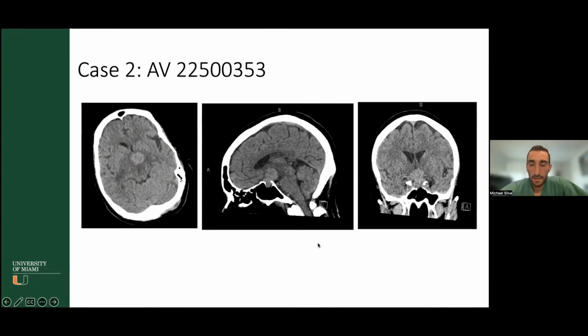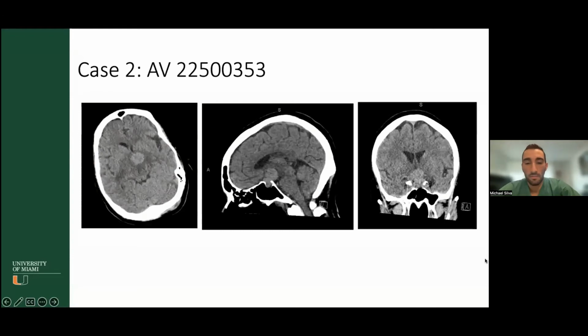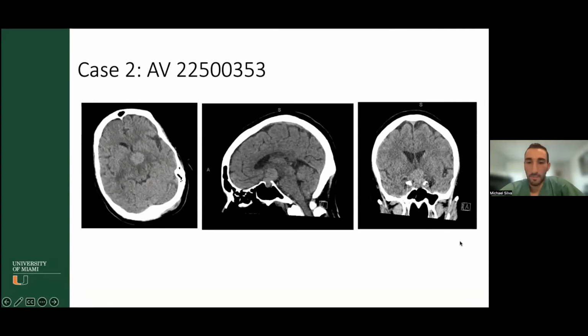What do you think about the location? How does the sella look? Where would you describe this tumor as being located? It's extending into the suprasellar region. And does the sella look normal, abnormal? Looks a little eroded. Yeah, I think that's a little bit of erosion, not insanely expanded though, right? So you could say there's a sellar lesion with a suprasellar component as well.